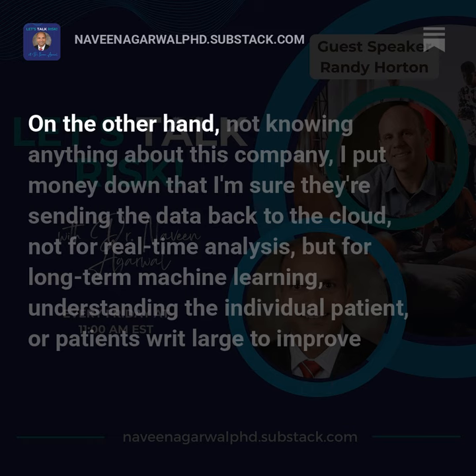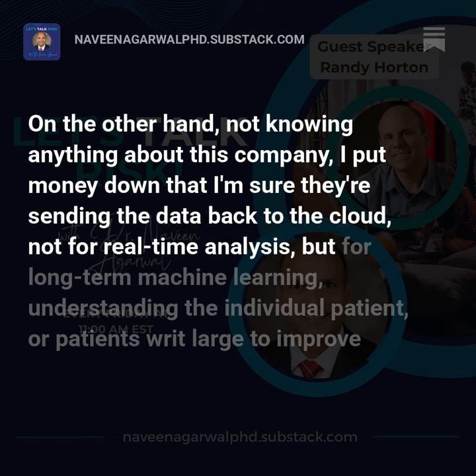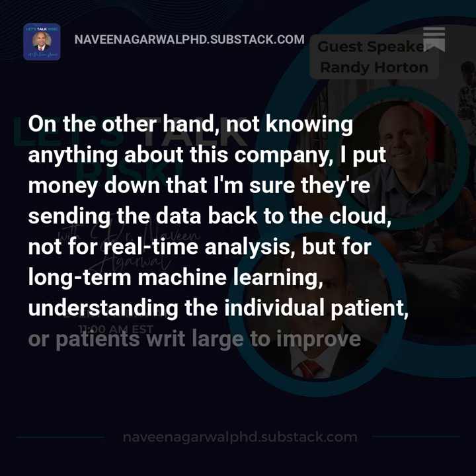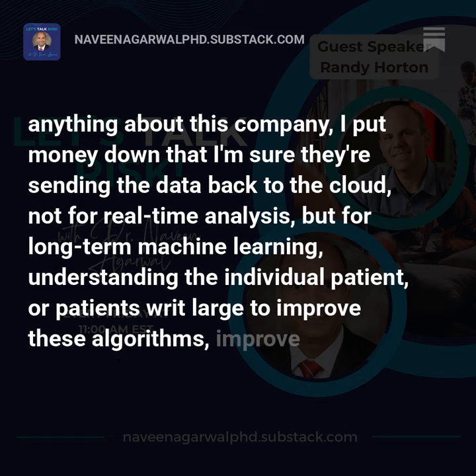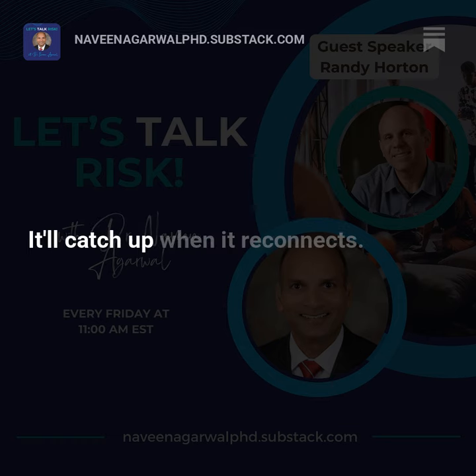On the other hand, not knowing anything about this company, I'd put money down that they're sending the data back to the cloud, not for real-time analysis, but for long-term machine learning, to understand the individual patient or patients writ large, to improve these algorithms and improve customization. But for the pieces they're doing, if connection's lost, it's okay. It'll catch up when it reconnects.